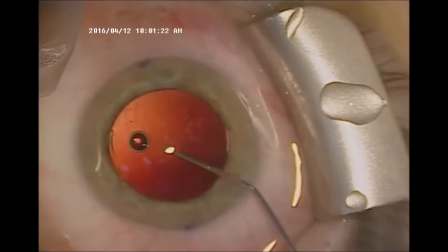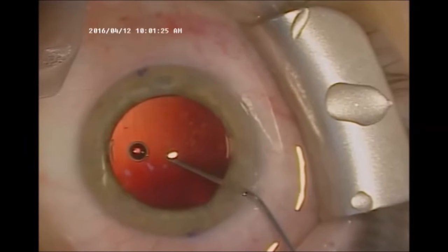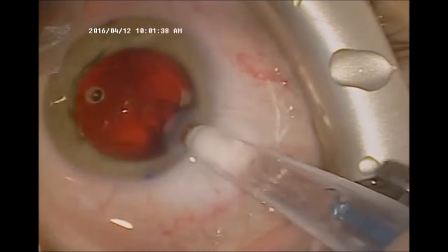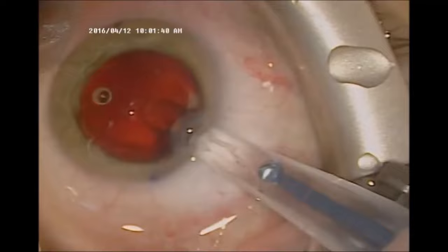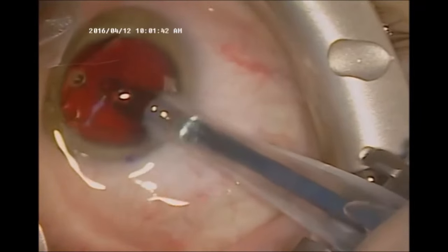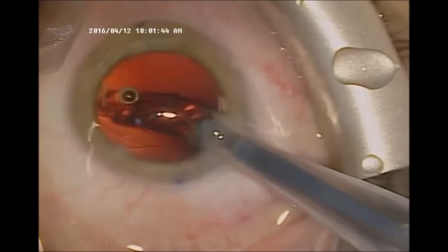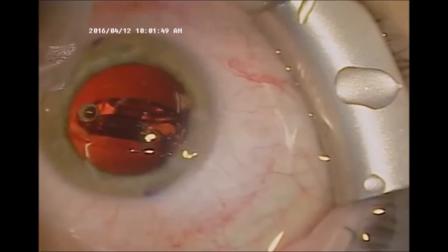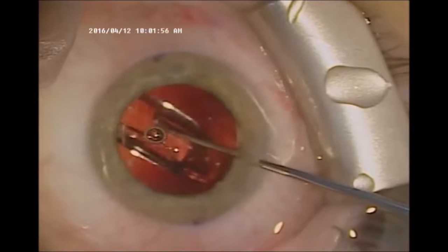Here I inject the eye with Viscoelastic again to make sure that it's firm, so that I may place the new lens. Here I am placing a Technis multifocal lens, one that will allow the patient to see both far away and up close. It is rolled up similar to a taco. And then I'll be using another instrument in order to unroll the lens within the lens capsule.